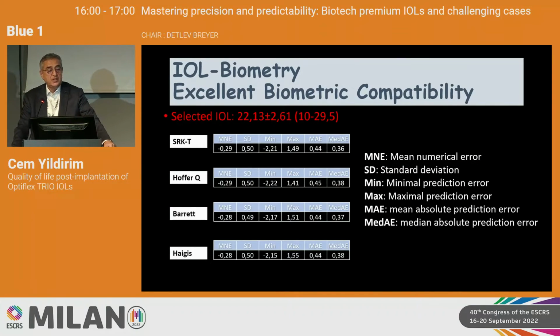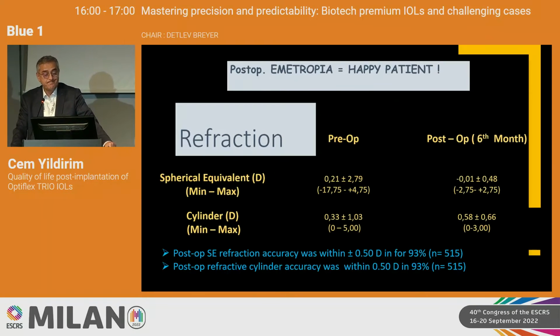We looked at the biometric results, and comparing them with the refractive results, we have an excellent biometric compatibility with this particular trifocal lens. And the SRK/T and Barrett formulas are much more comparable to the refractive results for this particular lens.